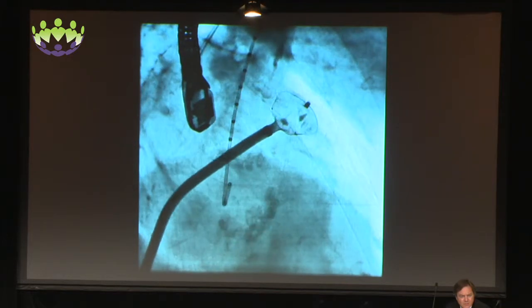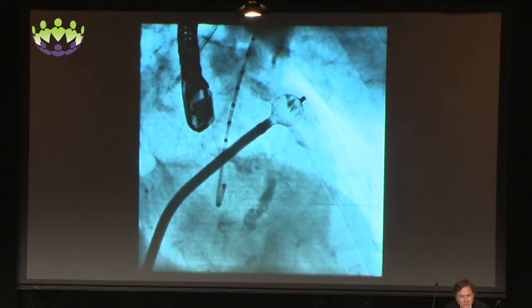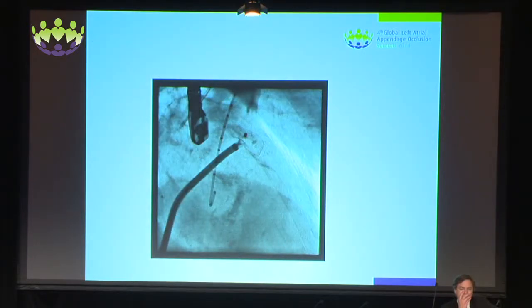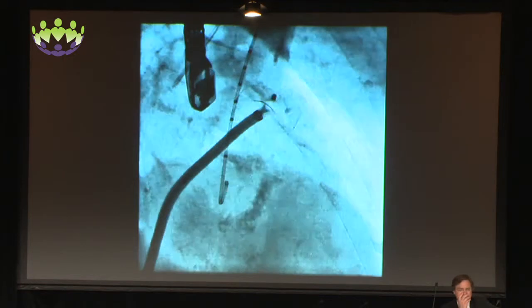My challenge at this point is to try and find that ridge. The technical demand upon me here is really to get this device to find that ridge. So I then take my shot, and I'm not really very happy that I found the ridge.